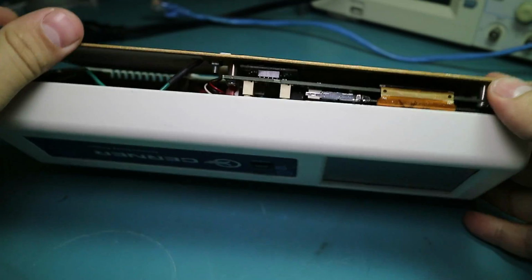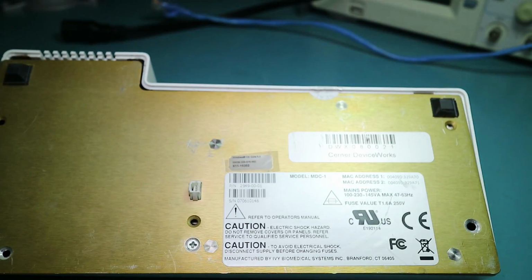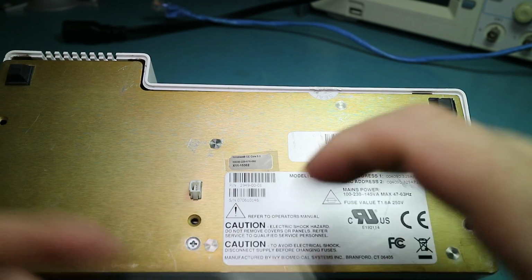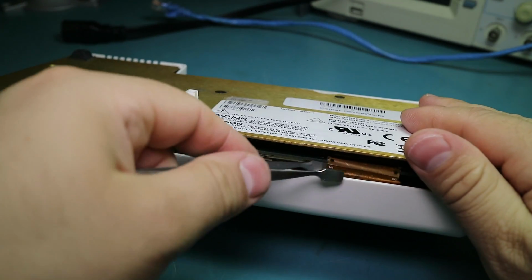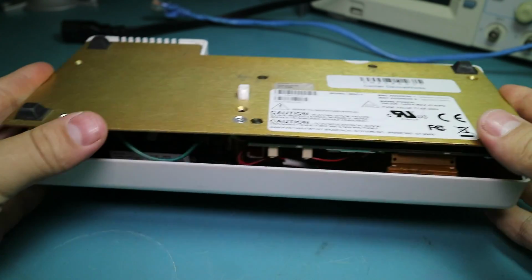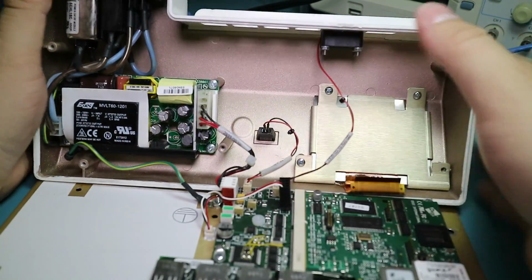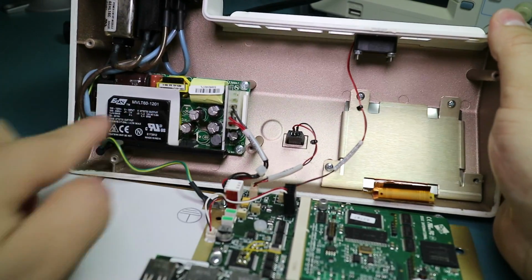And actually what I'm going to do is I'm just going to disconnect the TFT here. Let me get some kind of implement. These will do. There we go. And here's the inside. We've got a nice looking switch mode power supply.